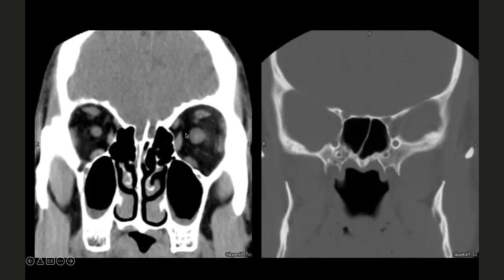This would be your coronal plane, right? It's a long cut along the coronal suture. And here you can see the superior, inferior rectus, medial, lateral rectus, your superior oblique. Well, one of you looking at it will say, Dr. Ram, something is wrong with one of my optic nerves because one looks smaller than the other.